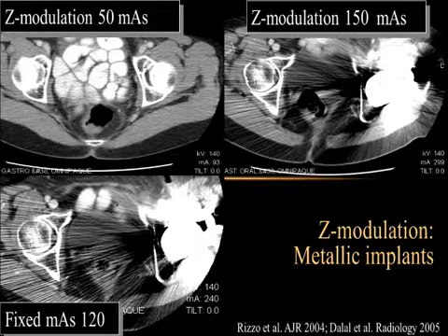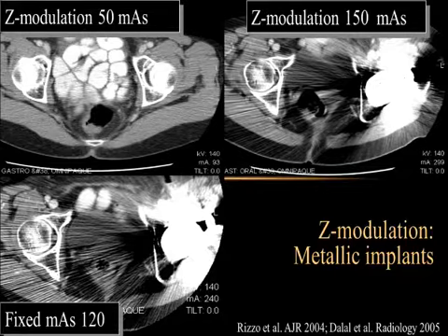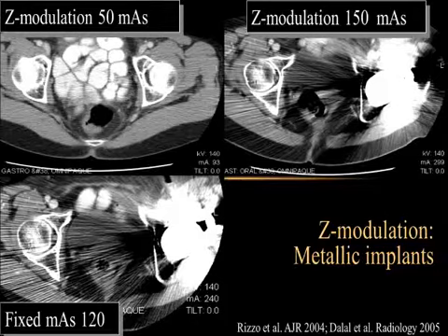When they see attenuation going above a certain point, they know there is metal, they know they cannot overcome those artifacts or image quality concerns with metallic implants, big metallic implants. I'm not talking about small clips or small screws. I'm only talking about big implants like a humeral prosthesis, big spinal rods, or a hip prosthesis. Siemens and Philips would not allow their mAs to increase with metallic prosthesis compared to patients who do not have it. But for other vendors, you do have to trim. You do have to put a maximum mA that is lower. Otherwise, the mA will go up, but you may not note improvement in the image quality.